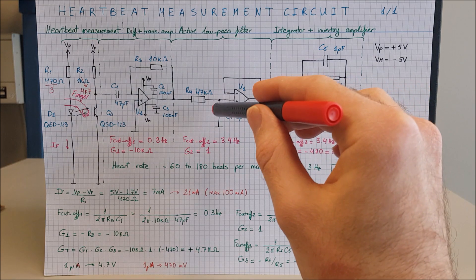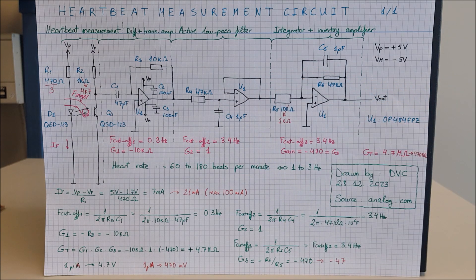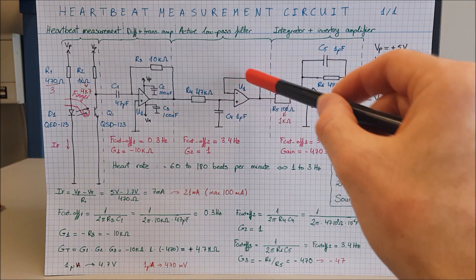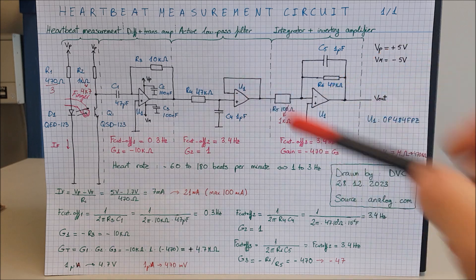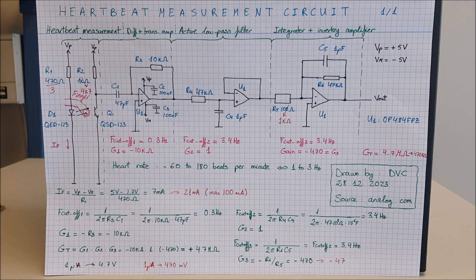Now the problem with this arrangement is that if you load the filter, the amplitude is going to go down considerably because this cannot source much power. We solve this with this buffer. The buffer has a high input resistance, meaning a high input impedance.